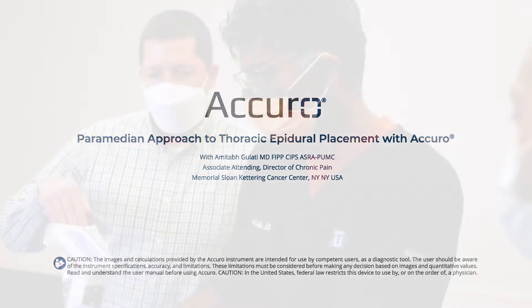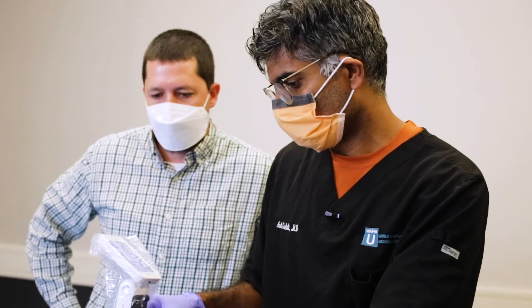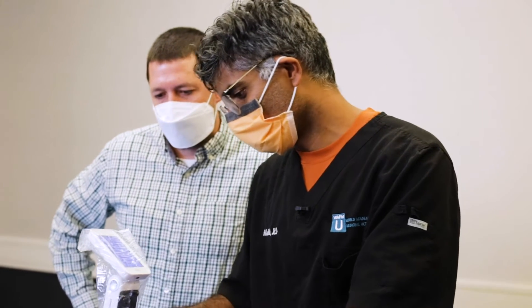Today I will be showing you how to place a thoracic epidural using the Acuro ultrasound guidance system.